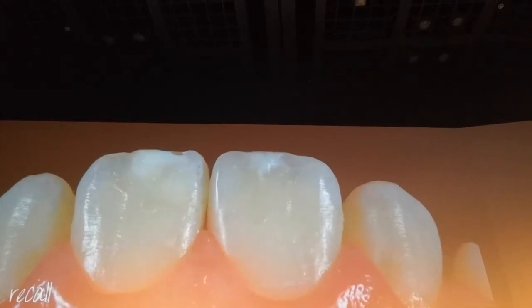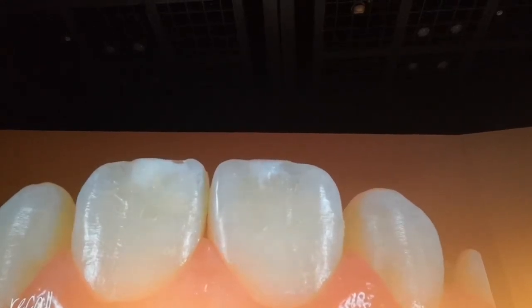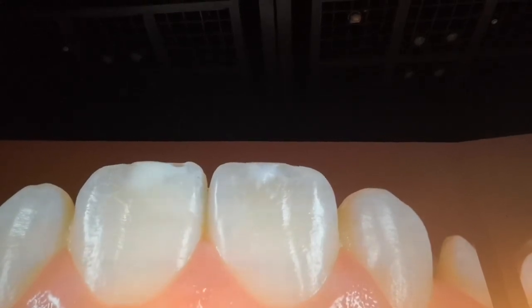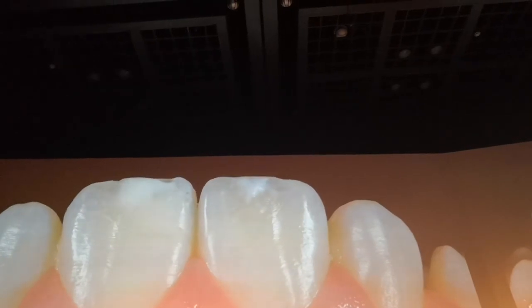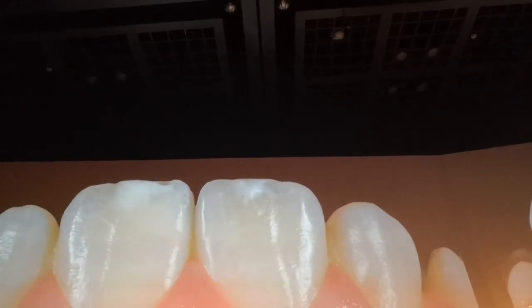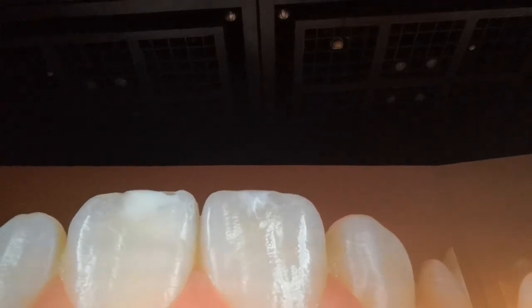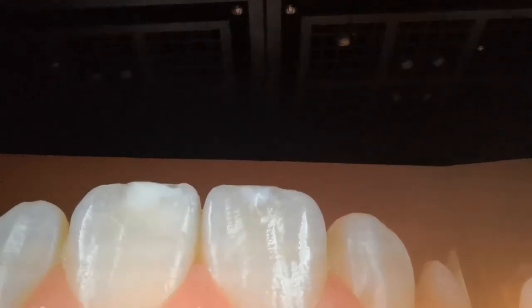Another picture after one week — but I made very nice finishing proximally. So I was sure that nothing was needed because the canine still doesn't go that fast. And another picture — you see that texture is important because whatever you do without texture there is no luster.